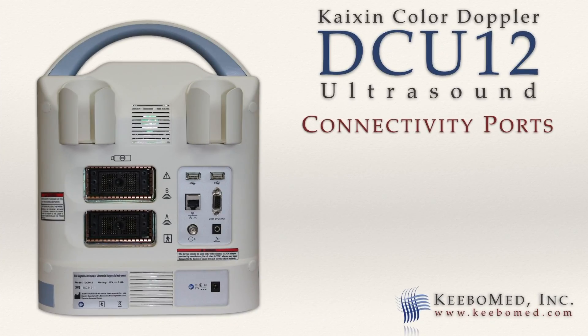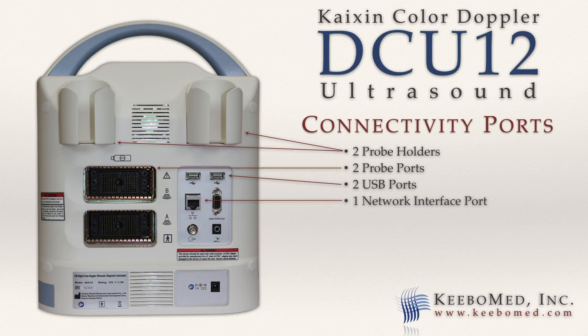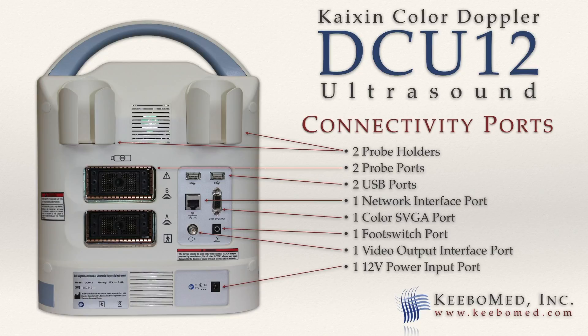The rear of the DCU-12 features two probe holders, two probe ports, two USB ports, one network interface port, one color SVGA port, one foot switch port, one video output interface port for use with a video printer, and one 12-volt power input port.